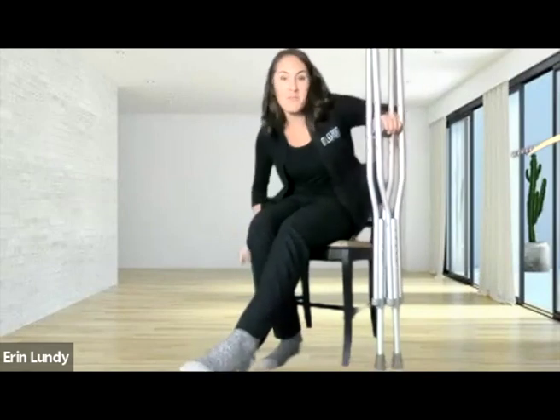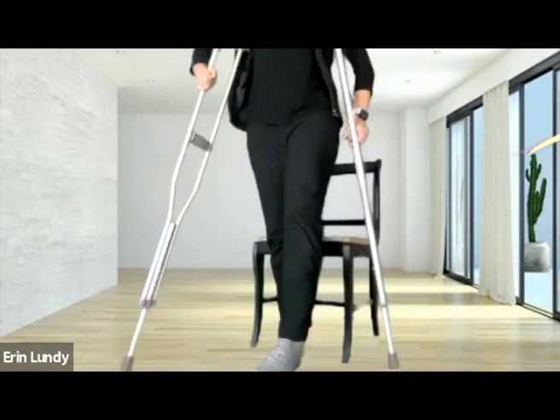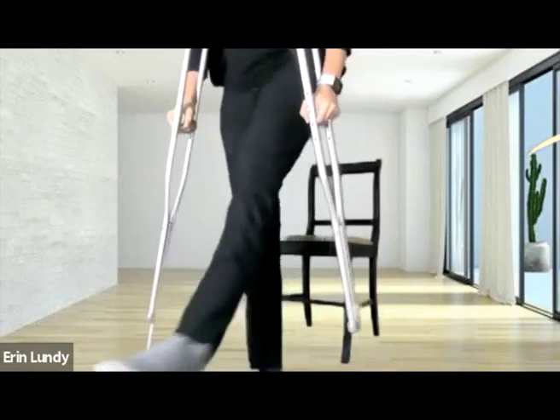Same principle for getting up. You bring your crutches around on both sides, and then if you have an armrest, it's even better. But you go to stand up, move your crutch over to the other side, and bam, you're walking away.